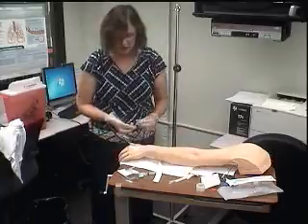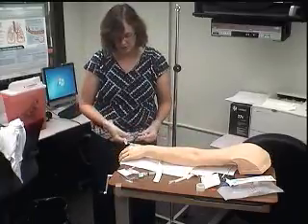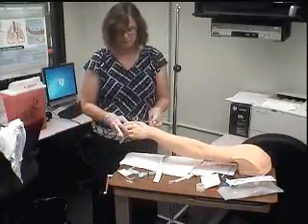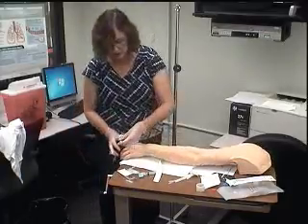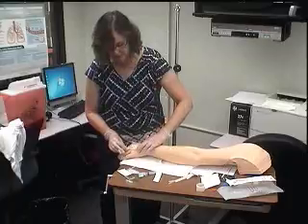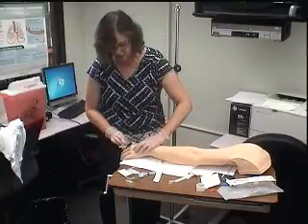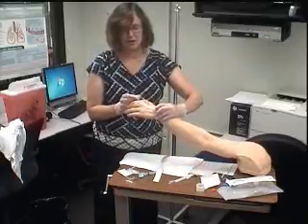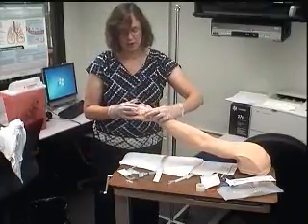Now it's still not secure enough for me. I still don't like this flopping around. So I'm going to take the other piece of tape and make a loop. When you make a loop, you want to make sure that your loop is in an area that it's not going to cause problems. You don't want it to be so loopy, though, that you cause a kink in the tubing, because then it won't flow correctly.